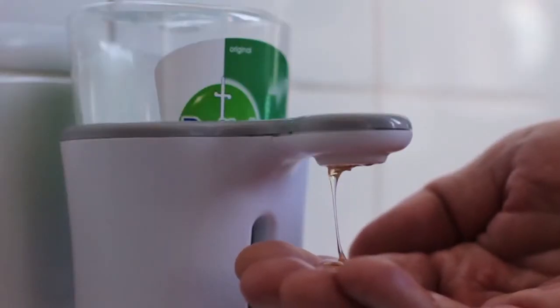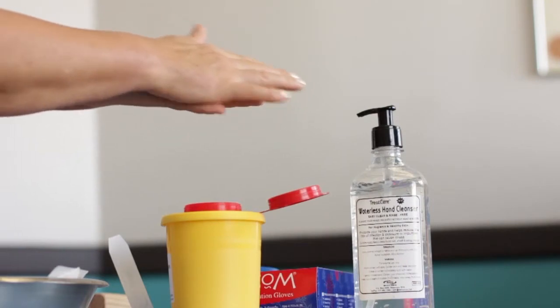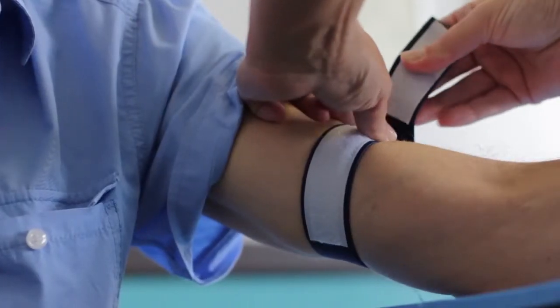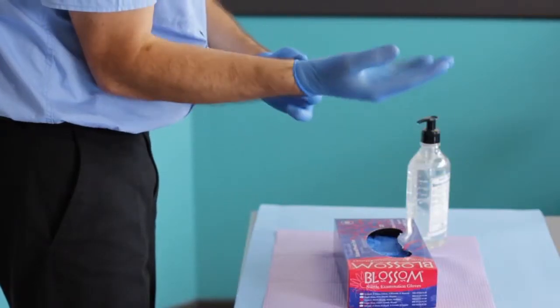Prepare your hands hygienically by washing with soap and water or by using an alcohol hand rub. Apply a tourniquet and select a suitable vein. Put on clean gloves.